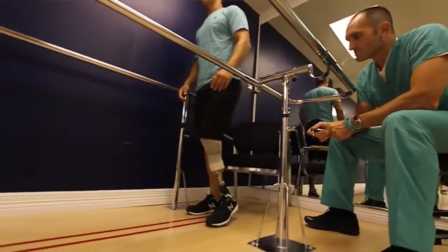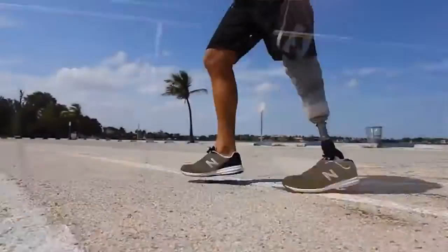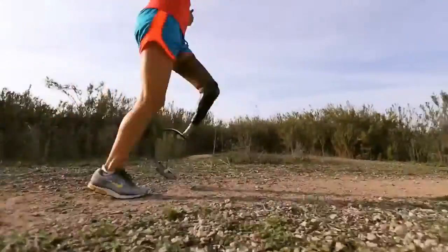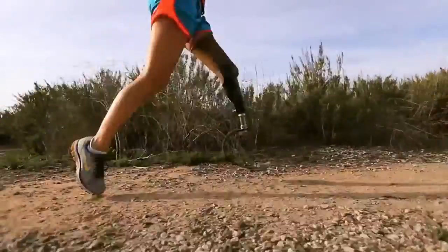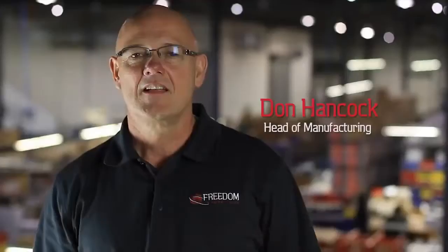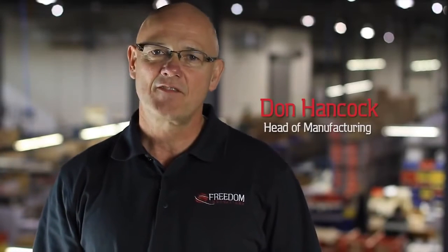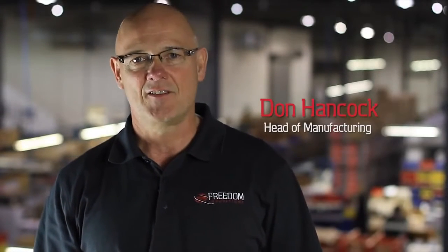Our goal is always to develop the highest functioning solutions that allow the prosthetists to achieve the clinical outcomes they desire while enabling amputees to reach their full potential. Our carbon fiber foot products are recognized as innovative solutions that are not only lightweight and durable, but offer the very best in energy storage and return. Part of the science of creating a truly outstanding carbon fiber foot is the manufacturing process. Let's see how it's done.